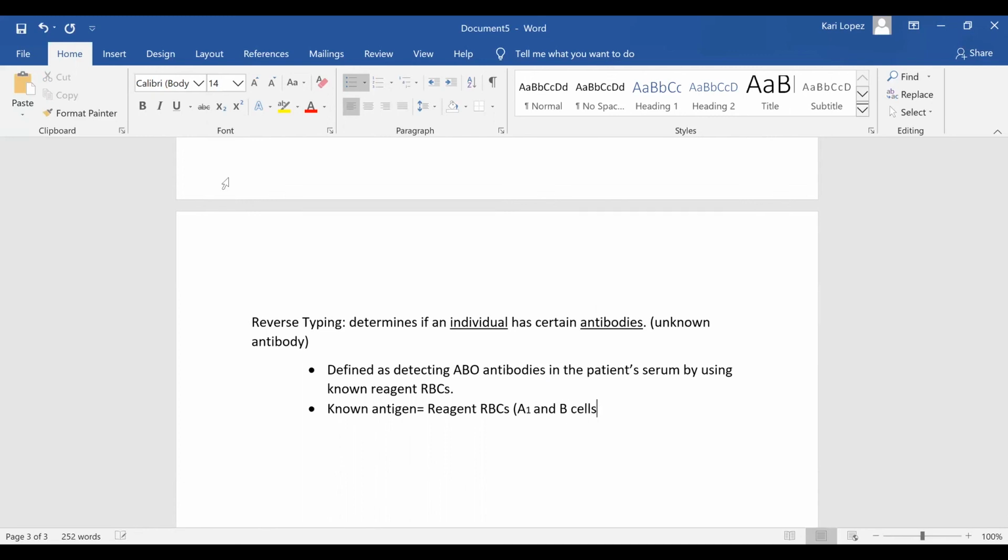And those are going to be red, just like the blood. And so what's important, if they are a blood cell product, you need to be mixing them properly and make sure that they are thoroughly mixed in an appropriate way.